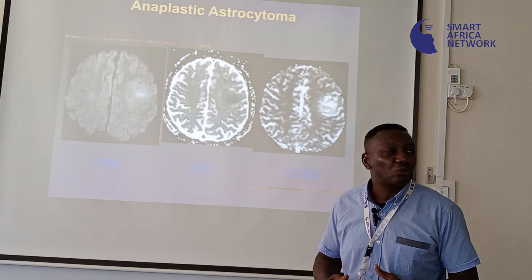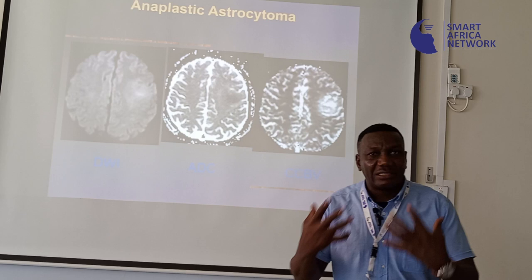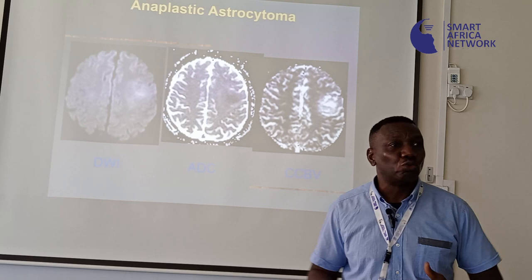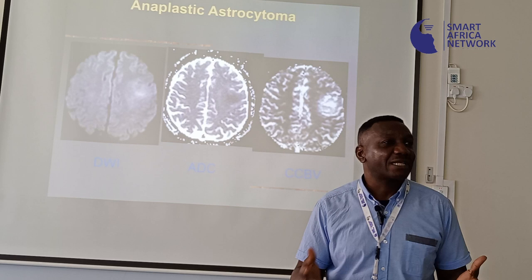You are not sure. There's a breast. So naturally, you should say what? It's a woman. But you also think, come on, there are some other men that have breasts, so you are worried. So you look for another sequence, another thing to do. What should you do to actually truly convince yourself that this is a man or a woman? What else can you do?